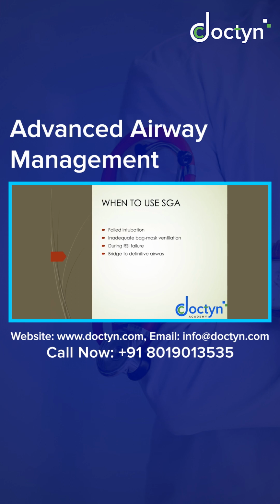Now, as I have said, oxygenation is paramount. The moment you realize that there is a failed intubation, you get back to maintenance of oxygenation, because during any attempt to insert the endotracheal tube or LMA, which could take 30 seconds, 1 minute, 2 minutes, sometimes more, we are not providing any oxygen to the patient. This is what you have to remember very much.